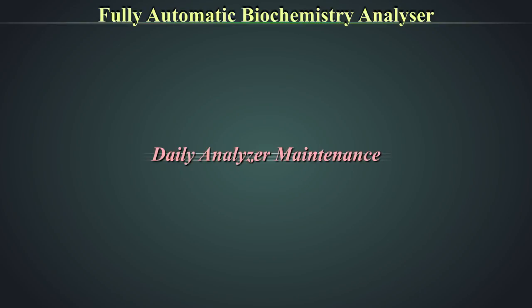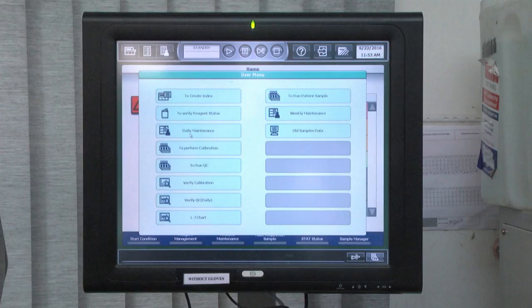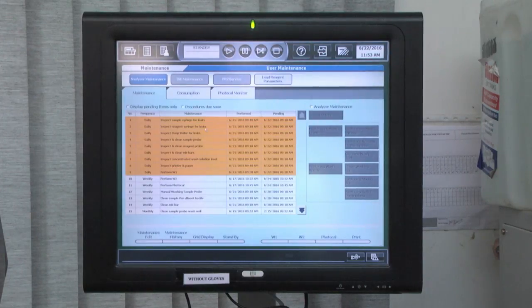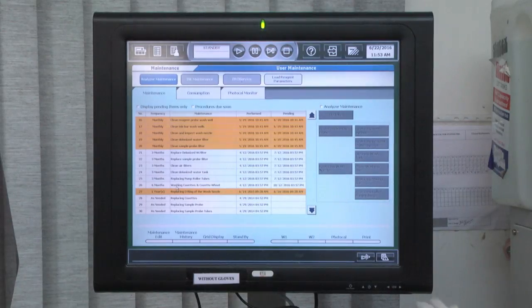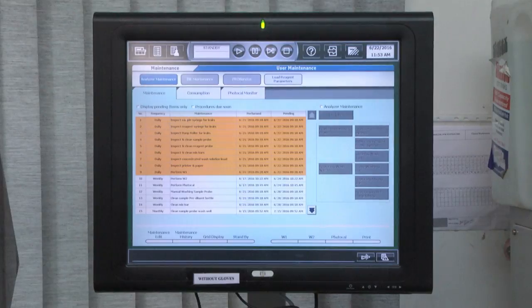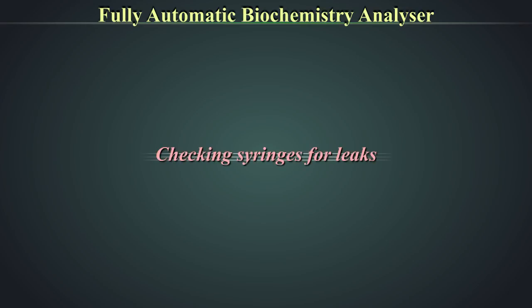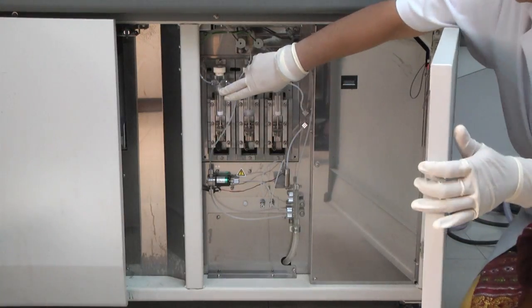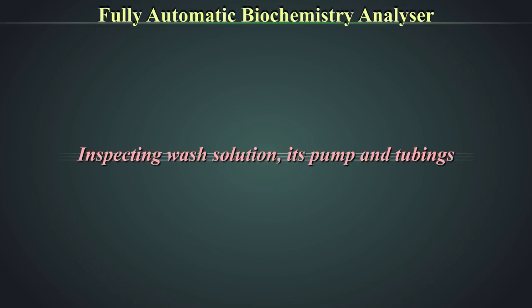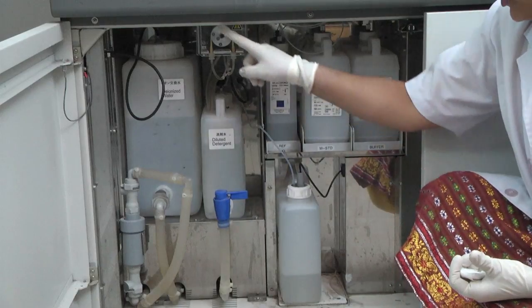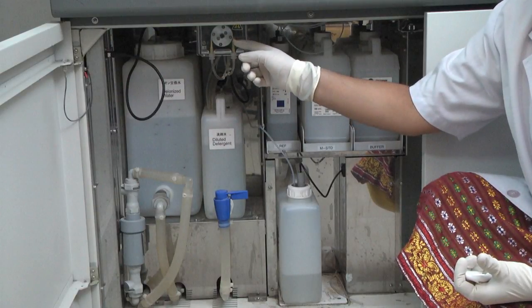Daily analyzer maintenance should be performed to ensure system performance and safety. It involves a series of inspections and replenishment of solutions. A maintenance schedule list, which acts both as a reminder and as documented proof, should be prepared per the equipment user manual and pasted near the analyzer. This includes checking all syringes for leaks, visual inspection for any cracks, leaks, or condensation, verifying they are screwed tightly, inspecting the wash solution, its pump and tubings, and checking if the solution is enough for the day's use, replenishing if needed.